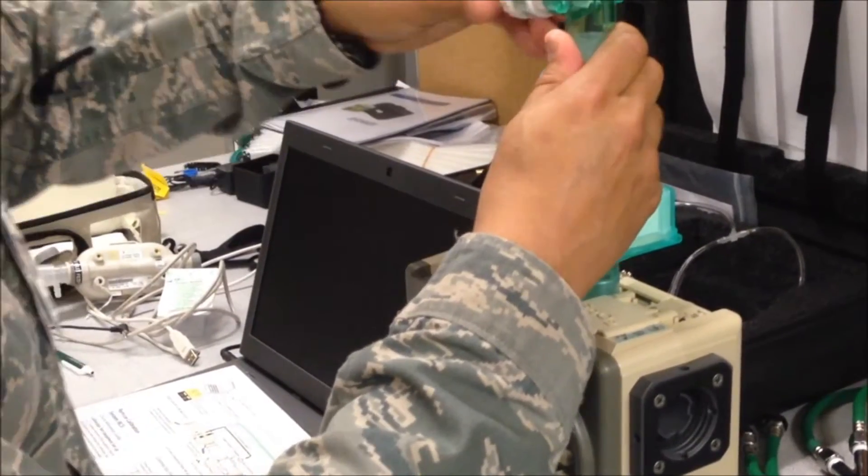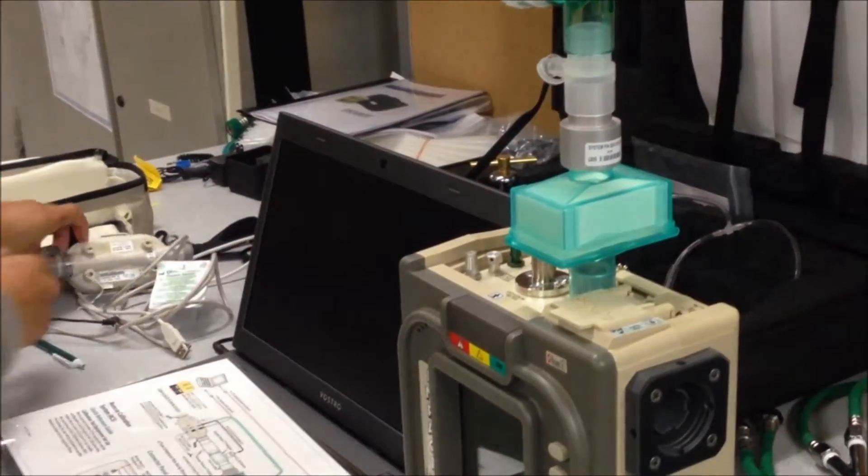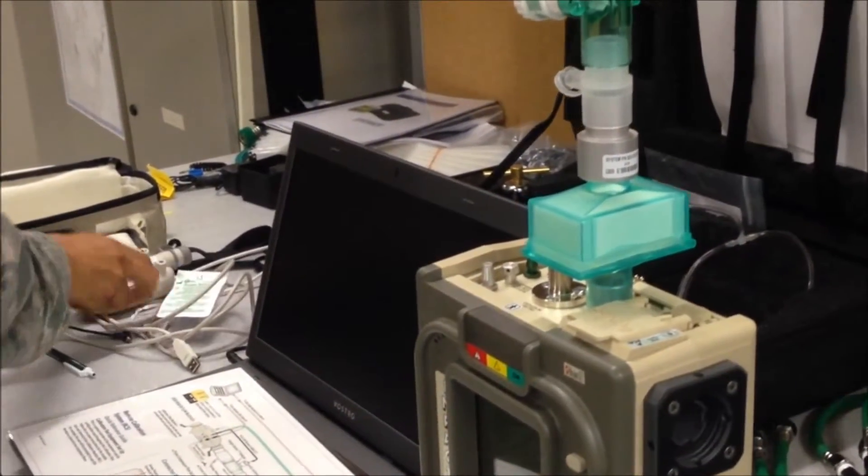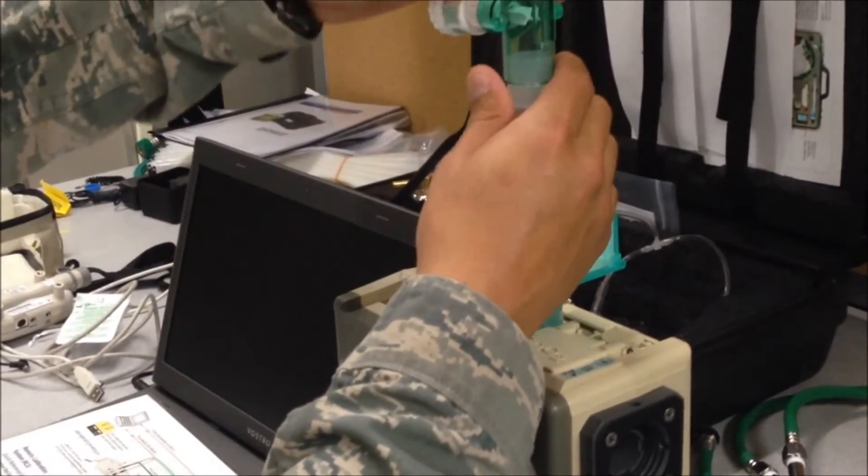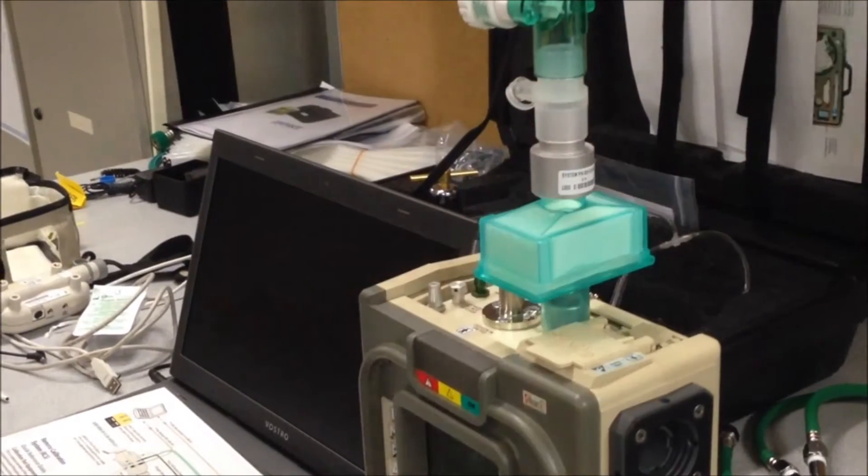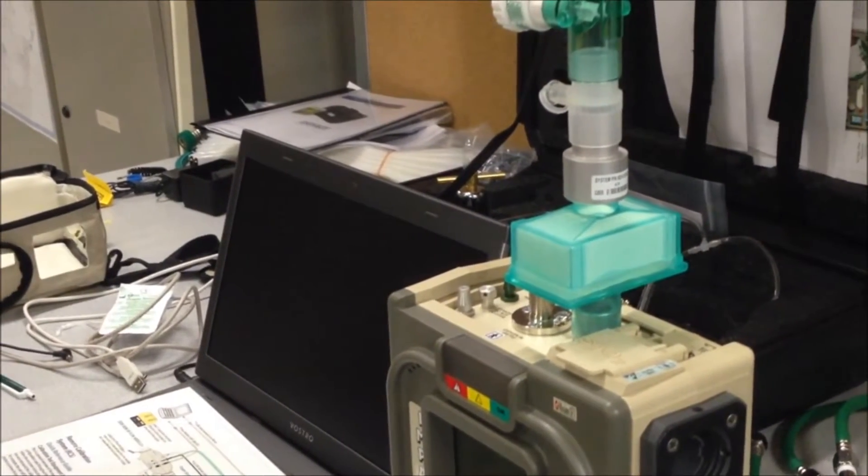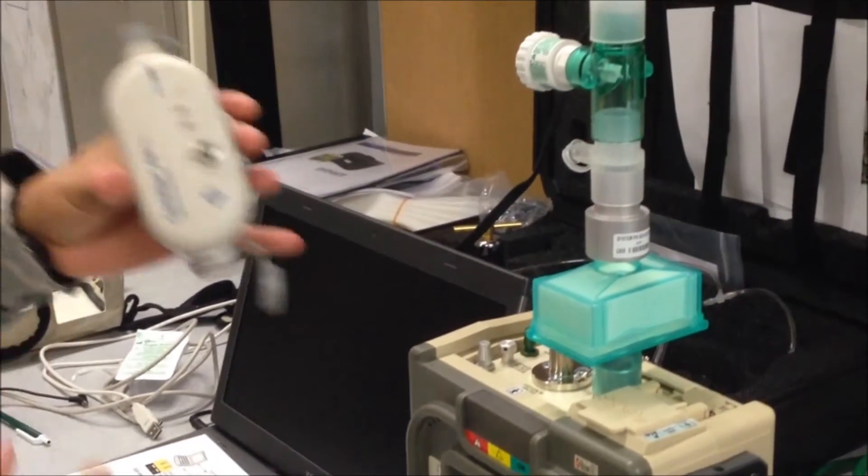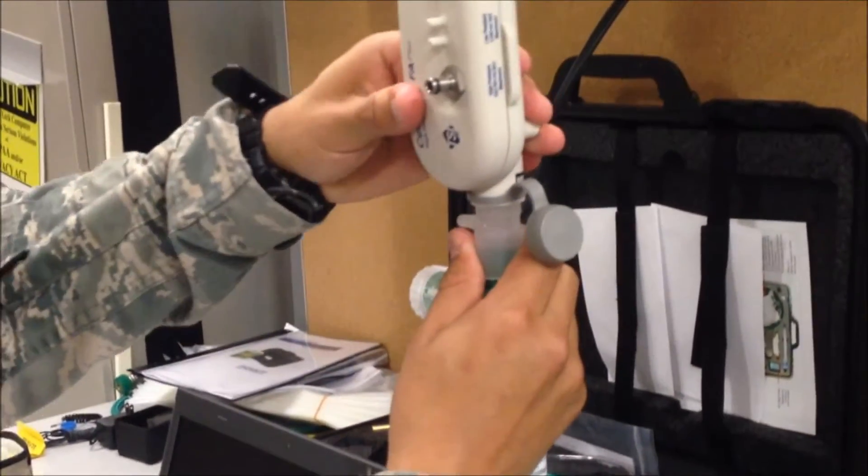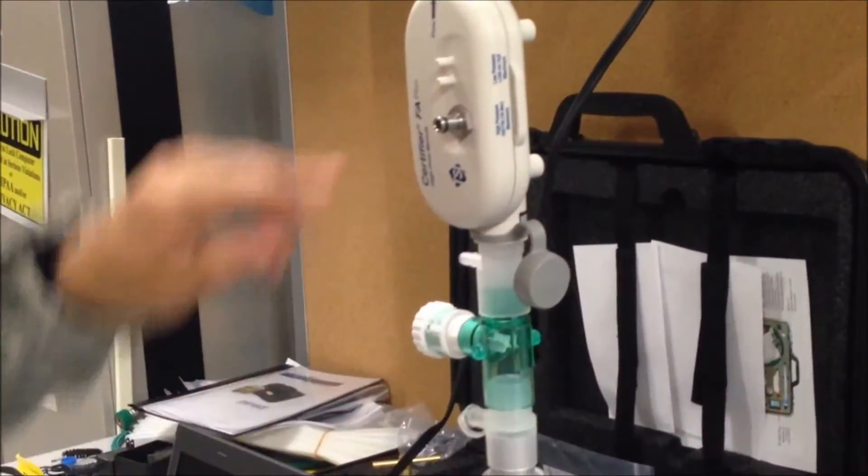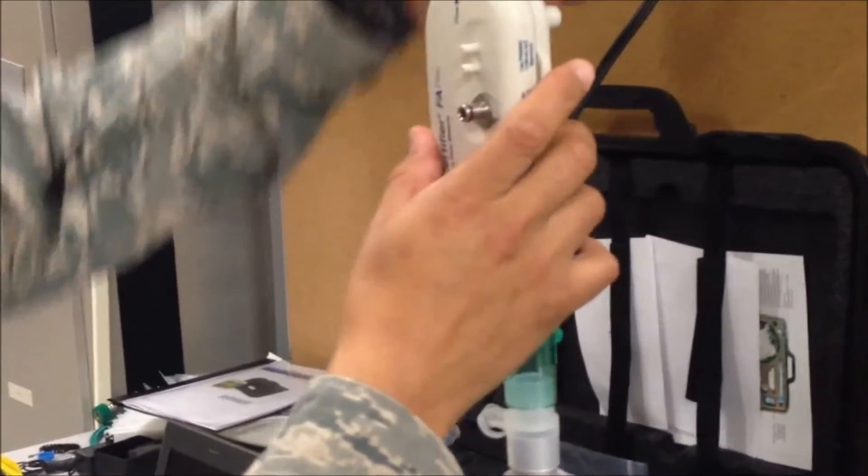Connect the airway pressure tubing and your calibration flow module. Make sure that when connecting, the flow line points up.